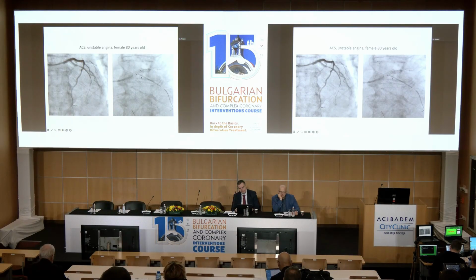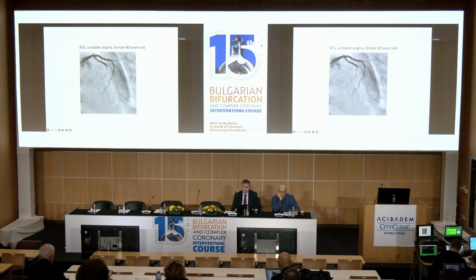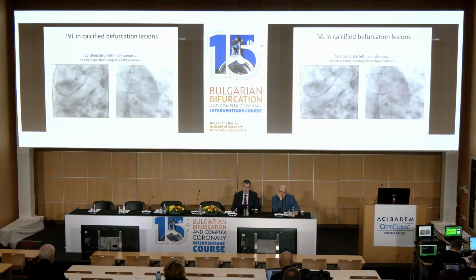So finally, you have to go ahead and do, in this case, a step. A very useful method is to use StentBoost or ClearStent, so you can see extremely well the position of the side branch. So finally, you can manage such a case with ablative methods very nicely.